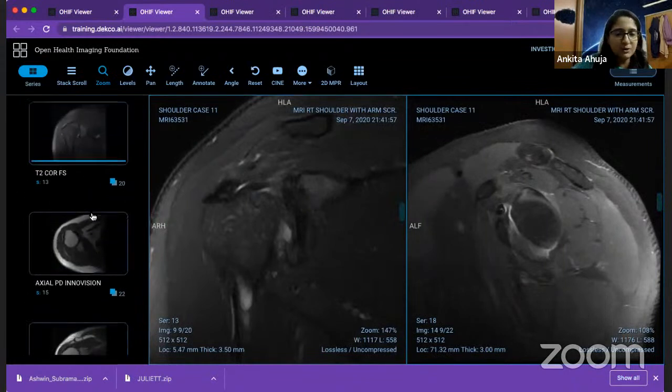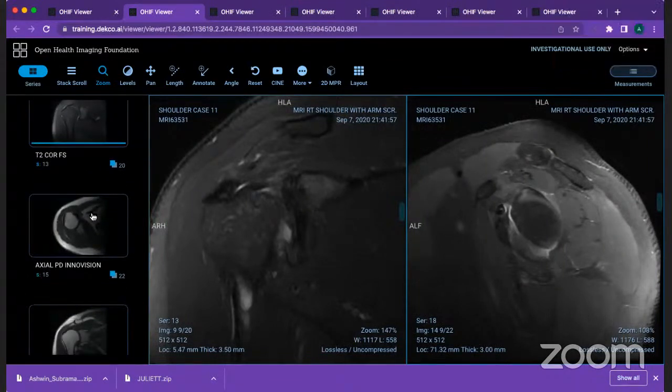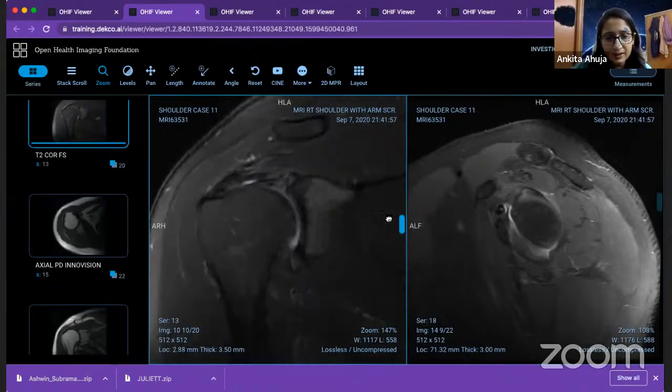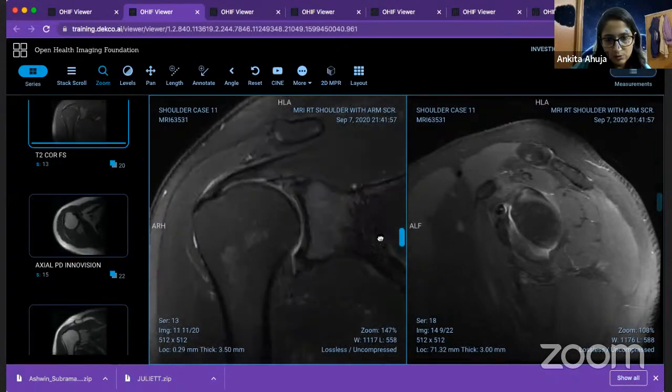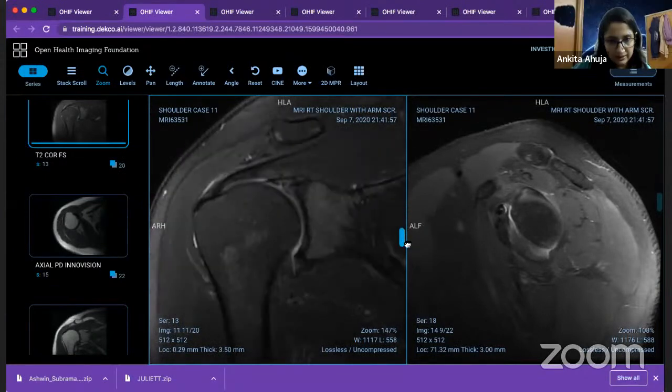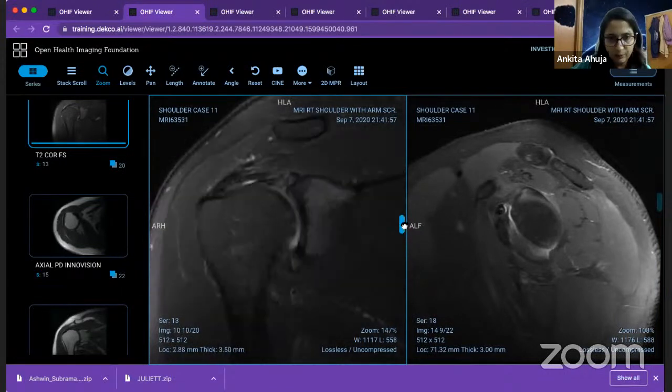Patient present. Sorry? Glenoid. Glenoid what? Sorry, I missed. I just heard glenoid. Did you say something in addition to glenoid? Is it a SLAP, please? SLAP. Yes, there is a labral tear. Completely agreed. You picked it up perfectly fine. So there is biceps labral junction fraying. We'll see it on axials also.